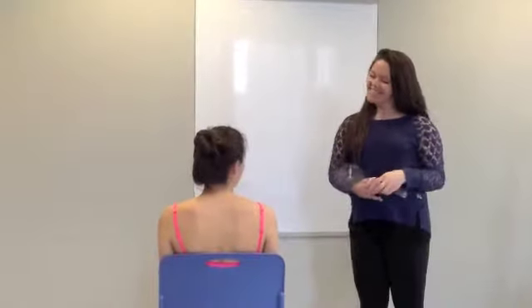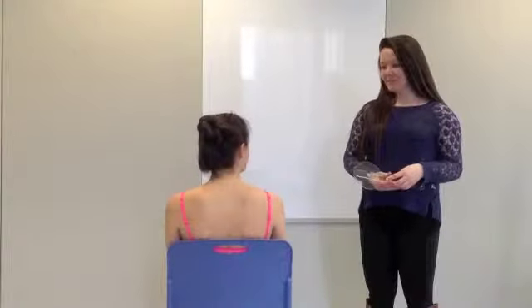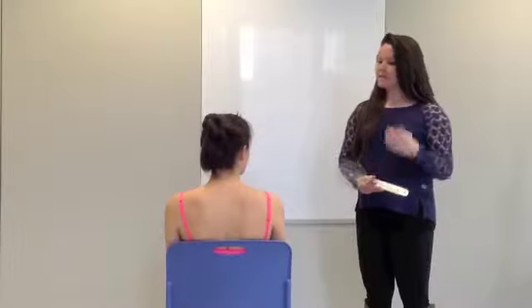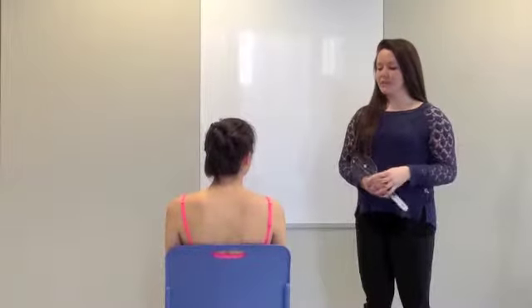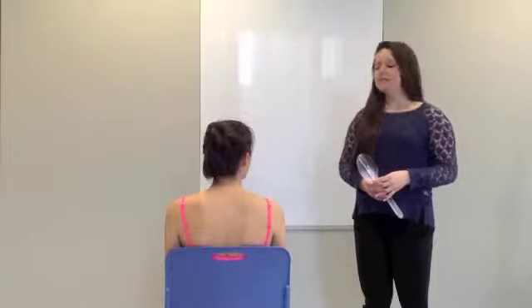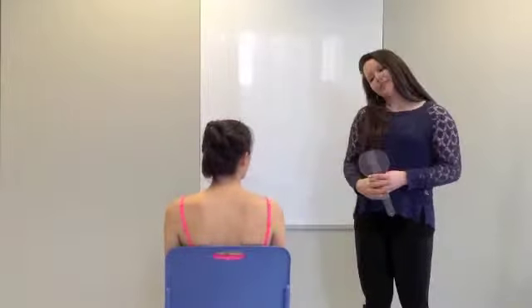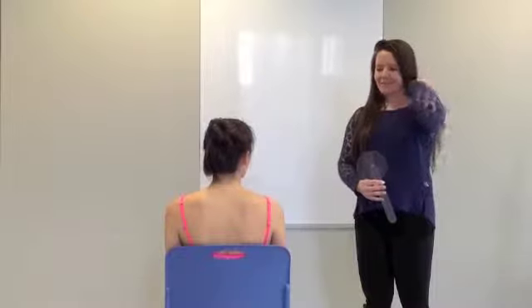Hi Kelsey, how are you doing today? I'm good. Good. My name's Erin O'Mani. I'm going to be your physical therapist today. Now, I know you've been experiencing a little bit of tightness in your neck. Is this correct? Yeah. Great. So what we're going to do today is we're actually going to measure your range of motion for side bending in your neck. So how close you can get your ear to your shoulder and in both directions. Does that sound okay? Yeah.